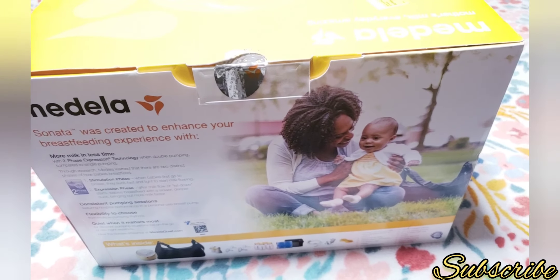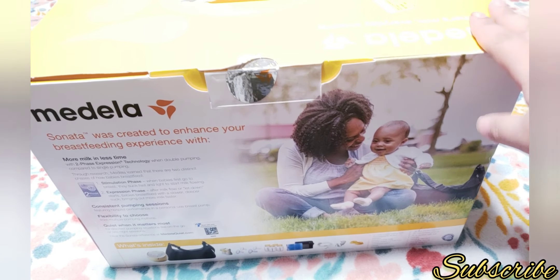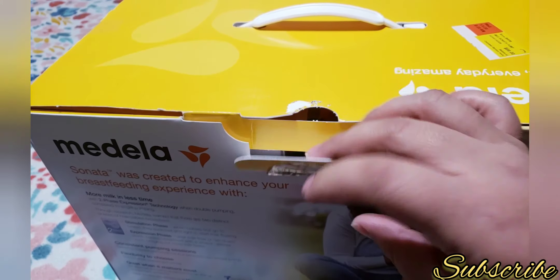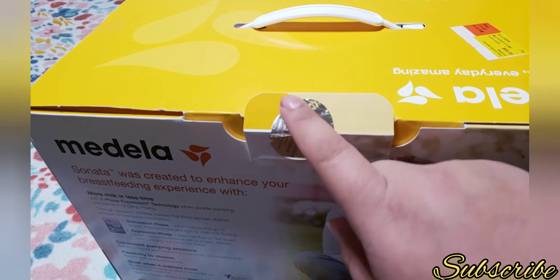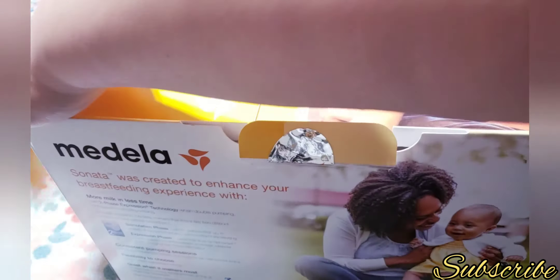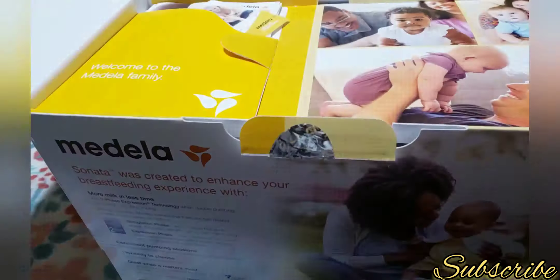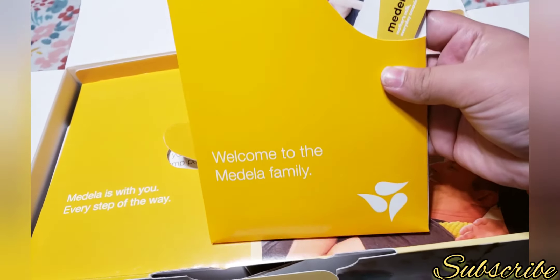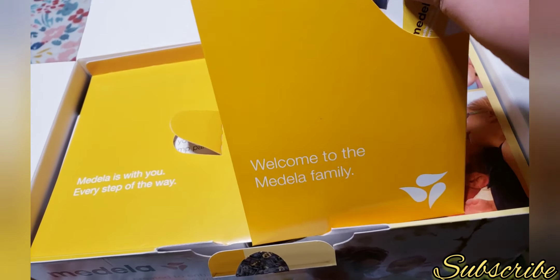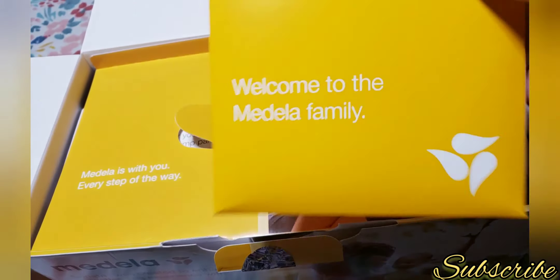As you can see I have the Medela Sonata breast pump. It's a really big heavy box. I already pulled the tab out so I could open it really easily. When you open this box, on top there's a little flap and it has these welcome to the Medela family instructions and all that.